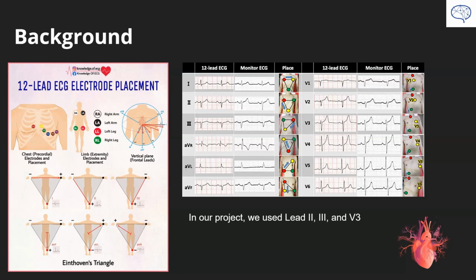The accuracy of limb electrode placement does not have much impact on the signal. However, the location of chest electrodes, V1 to V6 on diagrams, are critical. Studies have shown that even trained health professionals can misplace the chest electrodes. And one study found that only 10% of participants, including doctors, nurses, and cardiac technicians, correctly applied all the electrodes.